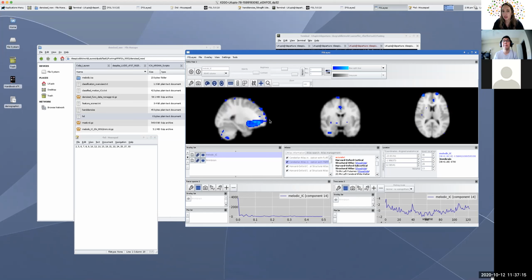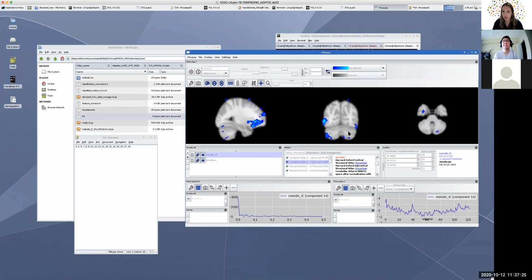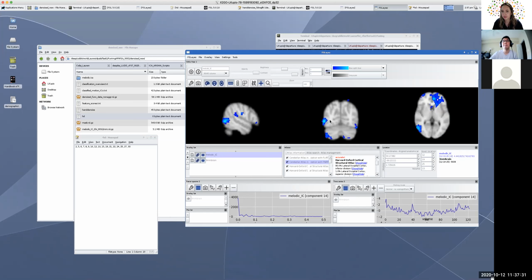If it's good signal, then it should still look like signal, versus if it's noise, it's kind of splotchy. So there shouldn't be a difference as you go through the different slices in here. If there is subcortical signal, then you should be able to see it okay. If that makes sense for you. Yeah, definitely. Thanks. No problem. And go for it.